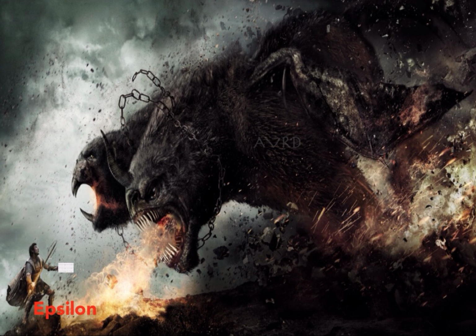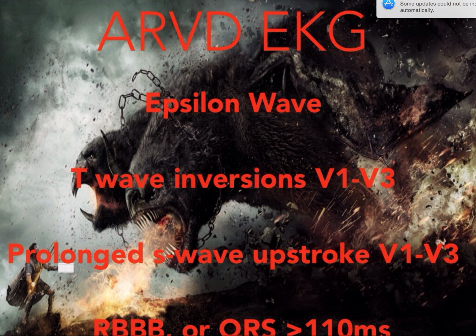So what do you do when this death monster of ARVD (I swapped these letters but didn't feel like going back and changing it) is coming for your patient? Well, all you need are two things. You need your EKG, which is here, and this trident of magical powers. So moving on, we'll focus on the EKG part of it.